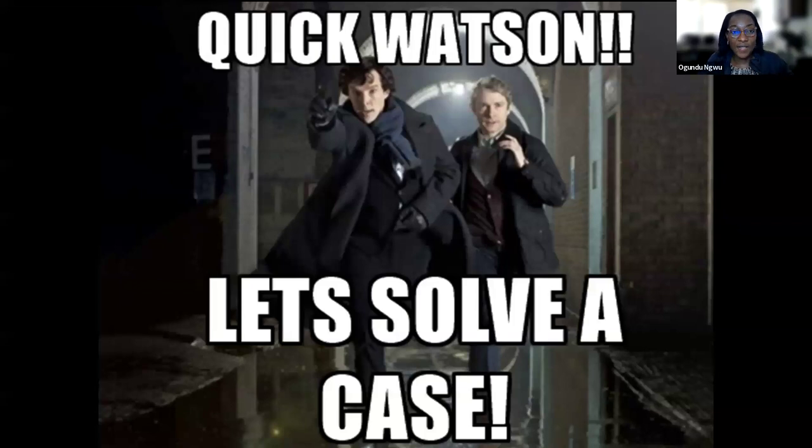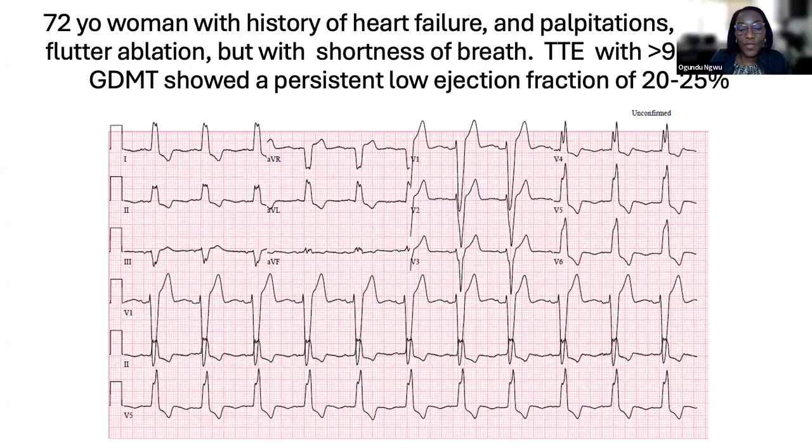We're going to start with solving a case. Some of the big centers here in the US actually run CRTD clinics, because once you implant it, it's always good to make sure that you're maximizing and making sure the patient gets the best effect from the CRT. So we start with a case study.